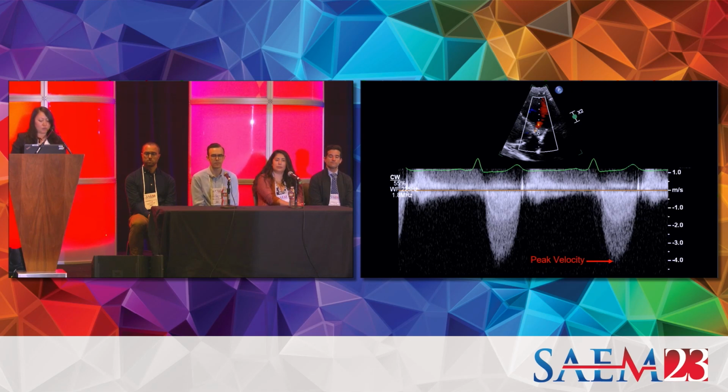So in this case, this person had an aortic valve peak velocity of a little over 4 meters per second, which is severe aortic stenosis.